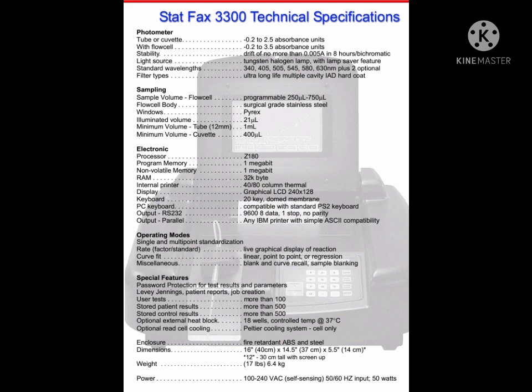Wavelength: it has 6 filters equipped and 2 optional positions. Filter types: ultra long life, multiple cavity, IAD hard coated filter. IAD, I previously also mentioned with some of the analyzers which I have mentioned already. So they also have IAD filter. IAD hard coating is there.